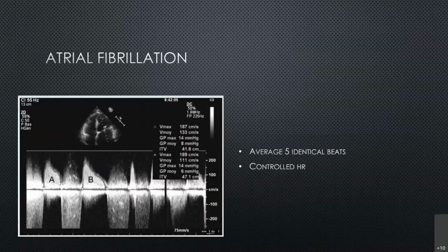And also, one thing I would like to reiterate is that basically because it's not commonly seen, it can be a little deceiving sometimes with the severity of mitral stenosis, especially if you're looking at the calcific one. Go by the gradients, and obviously you have to look at the heart rates. If there is any concern, you want to wait until the patient's heart rate is within optimal limits, then get better information again.